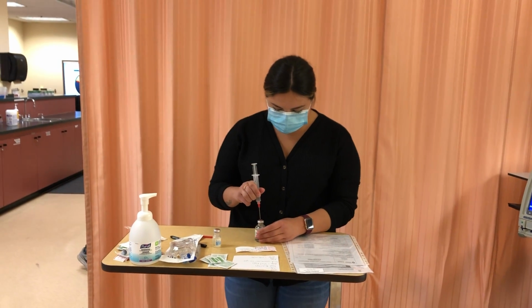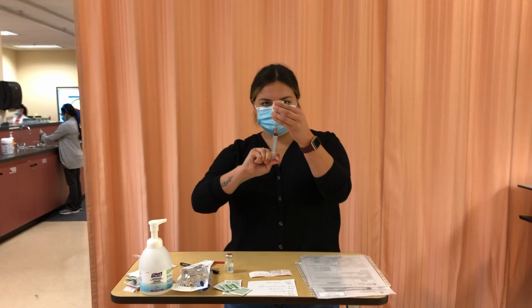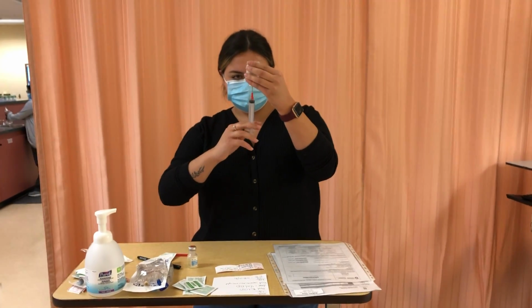For 30 seconds. It is now dry. How much time is left? Like on where? On there? Yeah. 8 minutes.